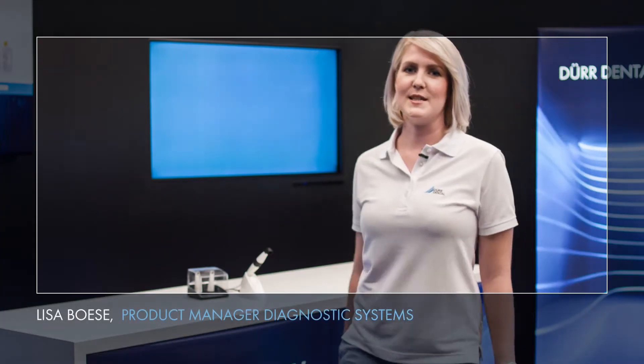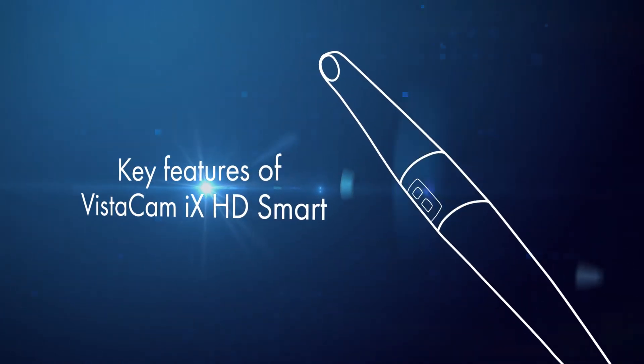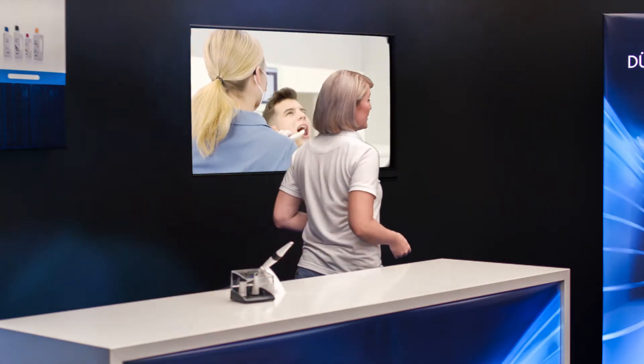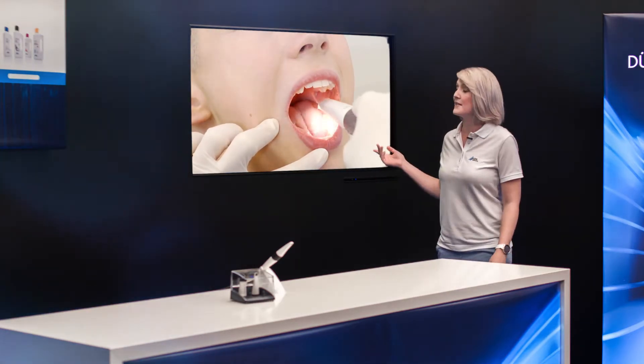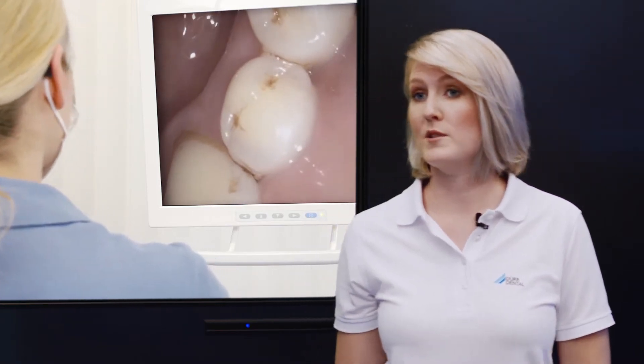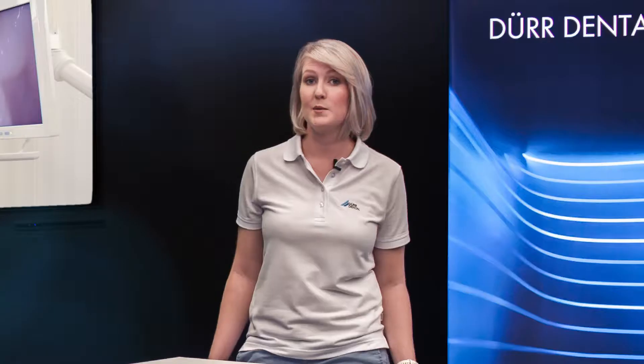Hello, my name is Lisa Böse and today I'll be showing you the Vistacam iX-HD Smart. With the Vistacam iX-HD Smart you can show the patient their own teeth in a way they can usually only be seen by the practice team. So you're allowing the patient to see for themselves what's actually going on in their own mouth. You're also able to clearly explain your diagnosis and treatment plan to your patient.